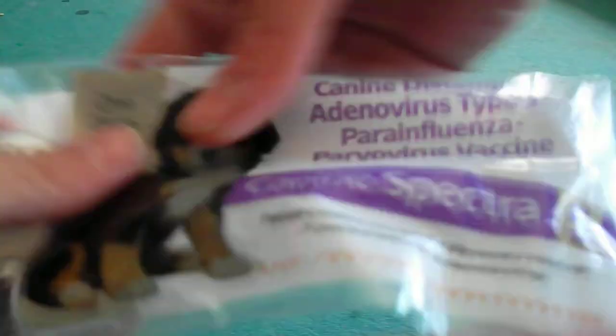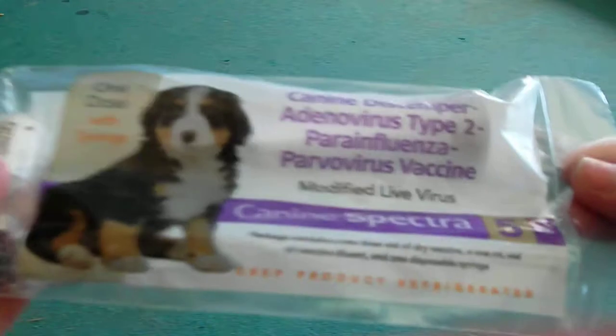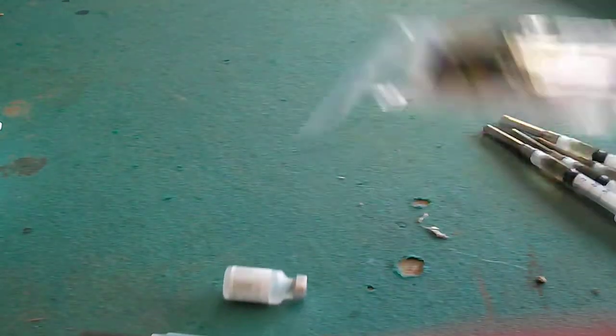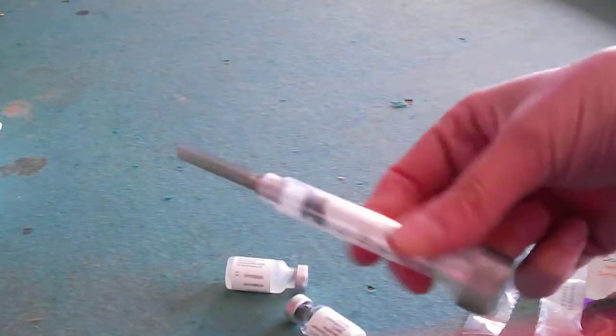How to prepare a vaccine. This is Canine Spectra 5. It's a puppy shot. It comes with syringe and needle.